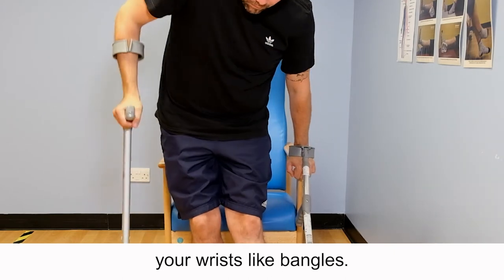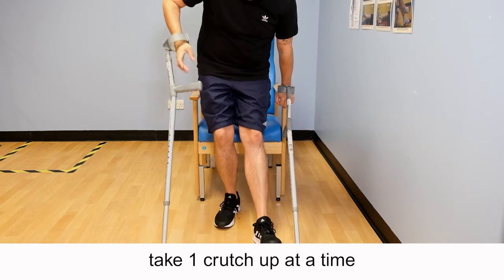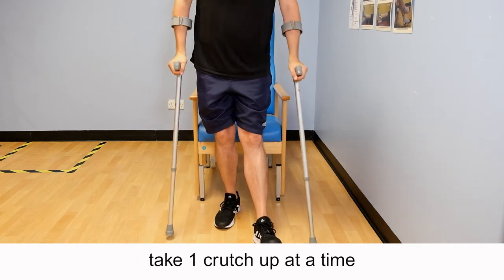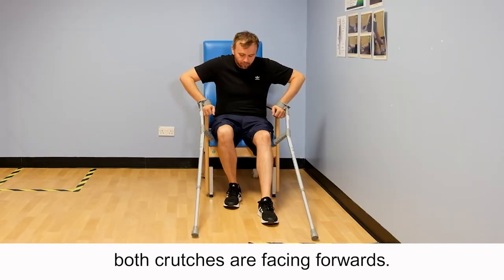Proceed to push up from the chair, taking one crutch up at a time to help steady yourself when upright, ensuring that both crutches are facing forwards.